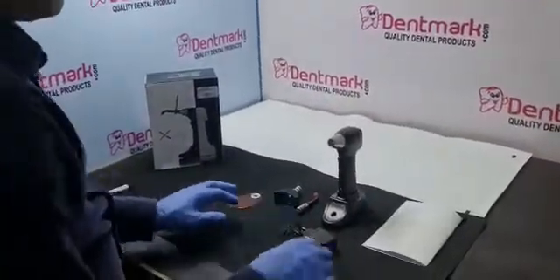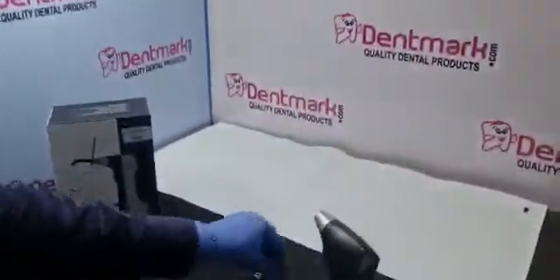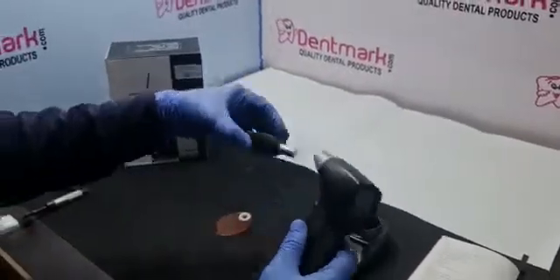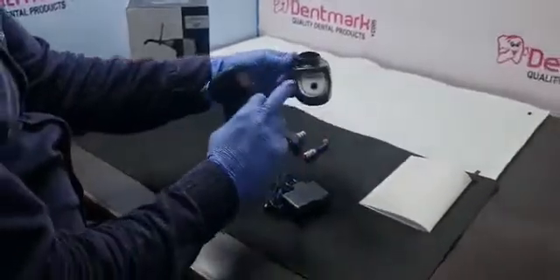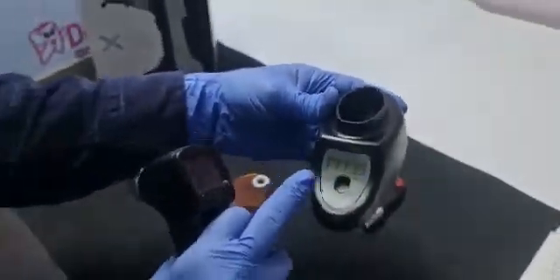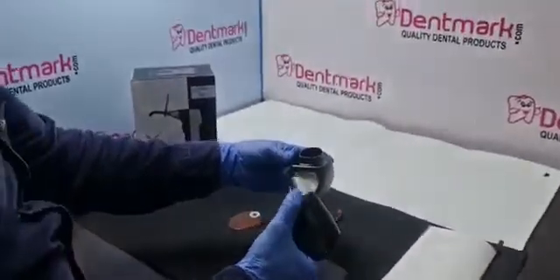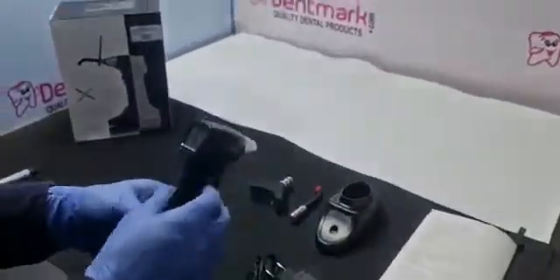This model has dual function — one is for curing and one is for bleaching. I will show you the functions also. The main advantage is it has the intensity meter, power meter. You can check the power anytime whether it is charged or if the LED is going bad, so you can take further actions.